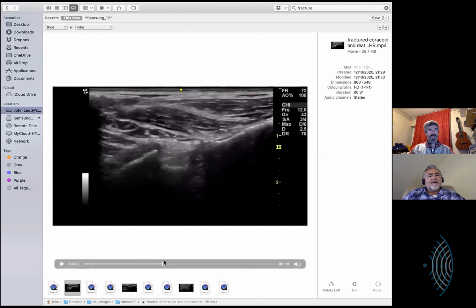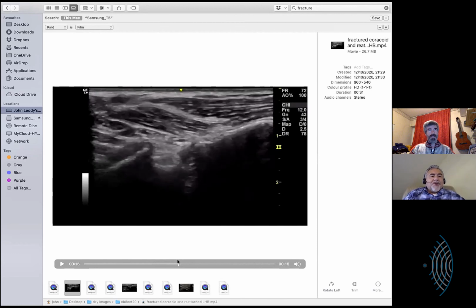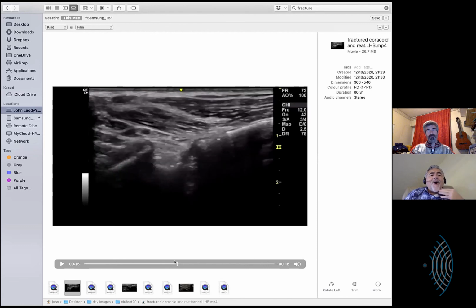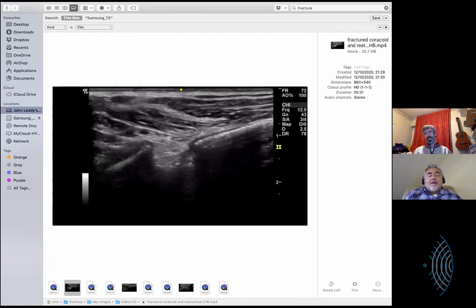But I wasn't really looking for that. I was just in shock that this patient turned up to me. Hold it right there. Are you long axis on the coracoid right there? Yep, and I'm moving it. Wow. So it truly was just a non-union. It'd been too long. It's not going to sit there and regrow. Nope, it's a fracture non-union.